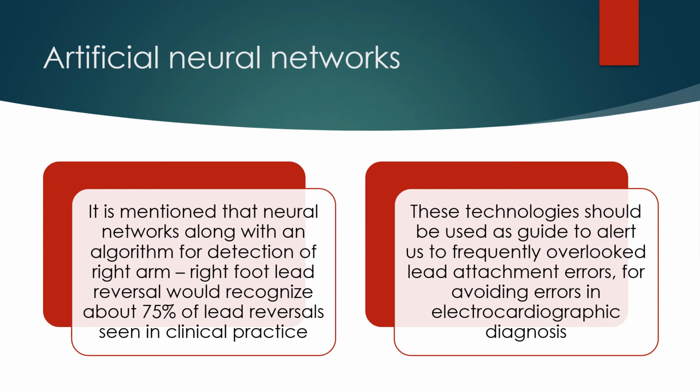These technologies should be used as a guide to alert us to frequently overlooked lead attachment errors for avoiding errors in electrocardiographic diagnosis.